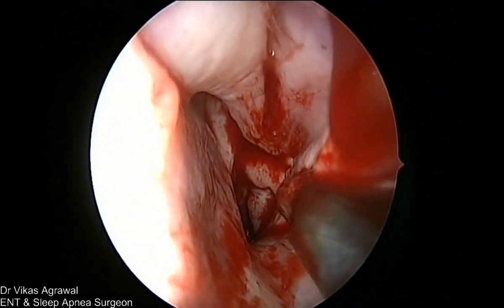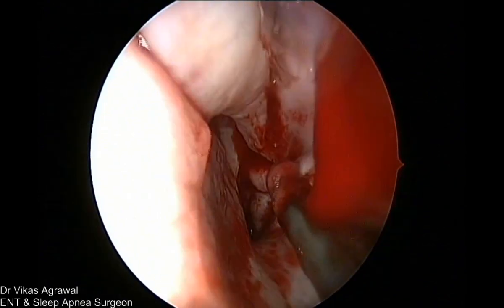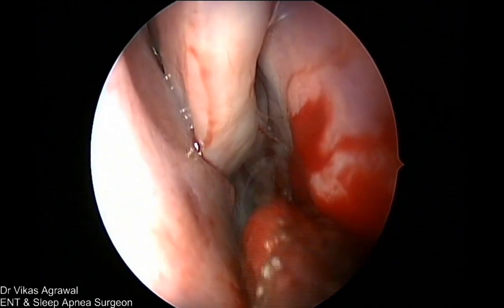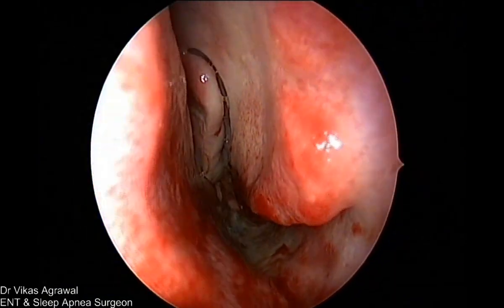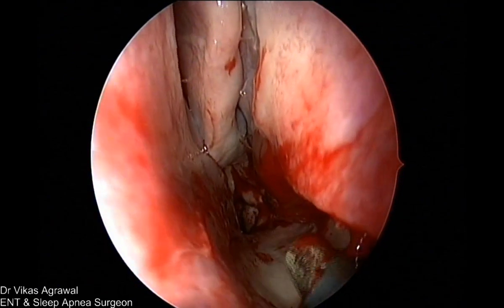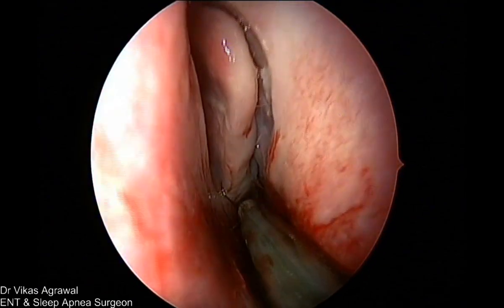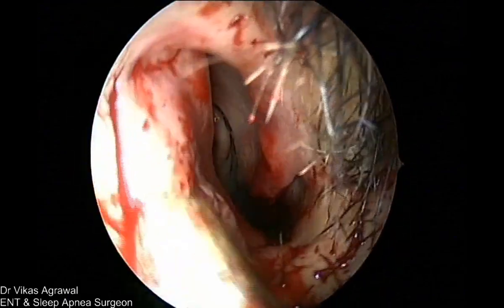Now I'll show you another thing. For all OSA patients, when you have done so much surgery, you have to do the nose packing. First of all, why are we doing the nose packing? Because this patient's tongue was not big, correct? If the tongue is big, you cannot do a nose packing in this patient. And even if the tongue is not big, obviously with so much surgery, we have to pack the nose. So we have to know what kind of nasal packing will be required: suture, gel foam and packing.